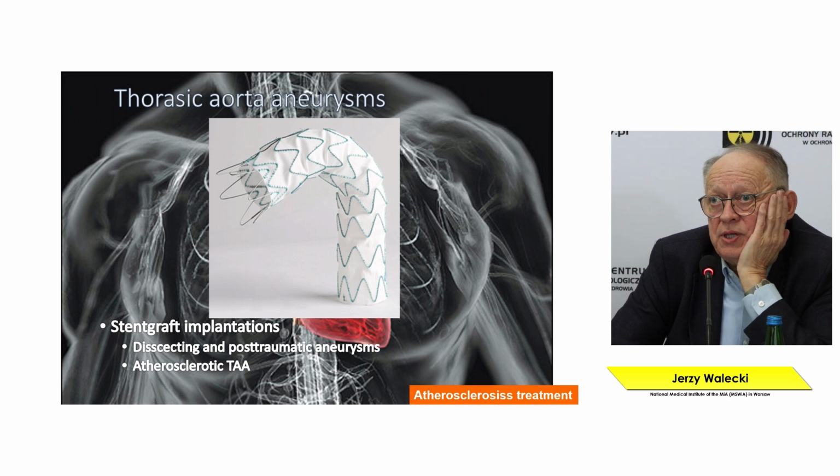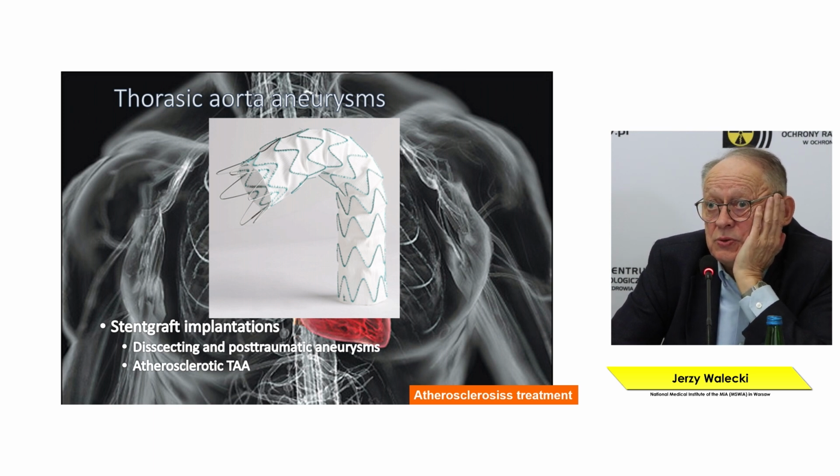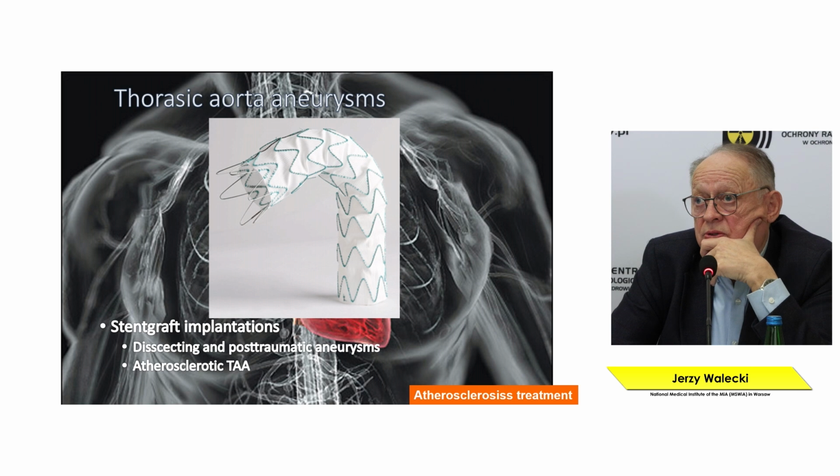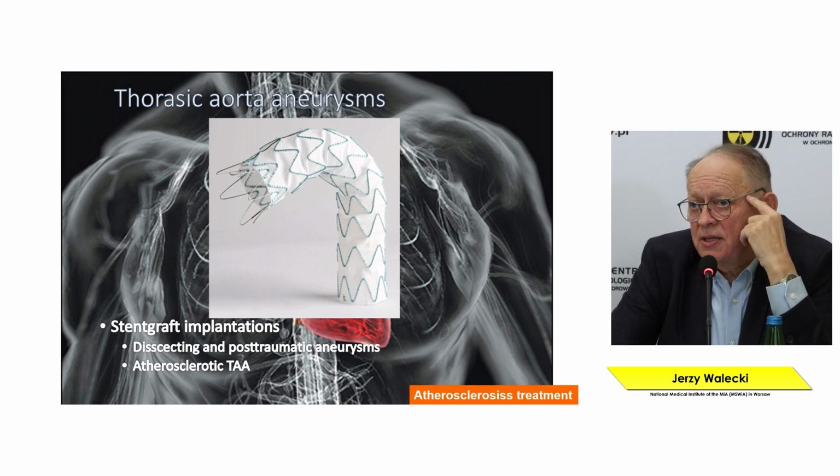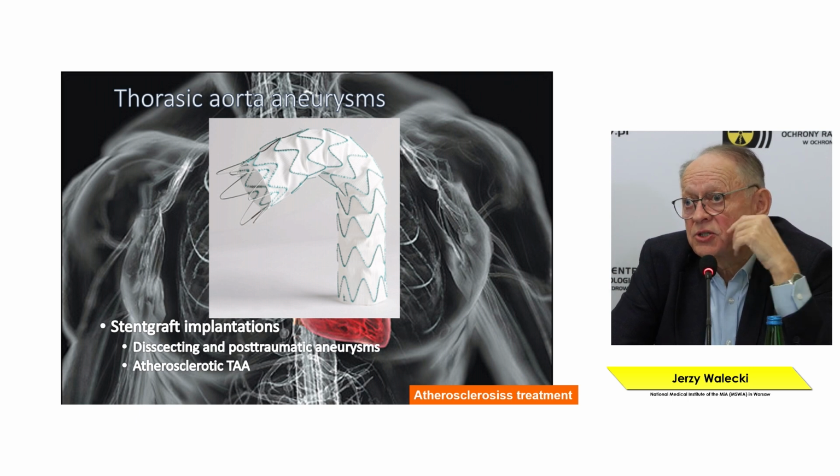Some changes at the level of great vessels. Here I mainly mean the aneurysms of the aorta. This is one of the major risks to life. So in our work, when we work during duties, telephone or stationary duties, if we diagnose an aneurysm, if there are some major pains, we stent such vessels, but this procedure has to be done very quickly.